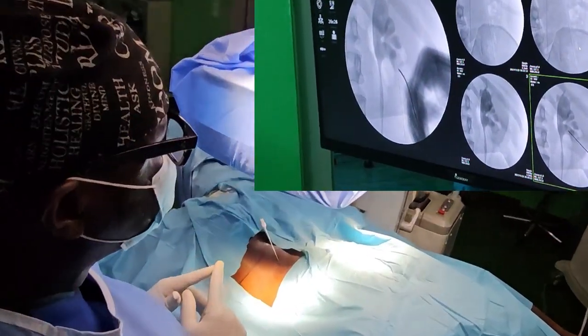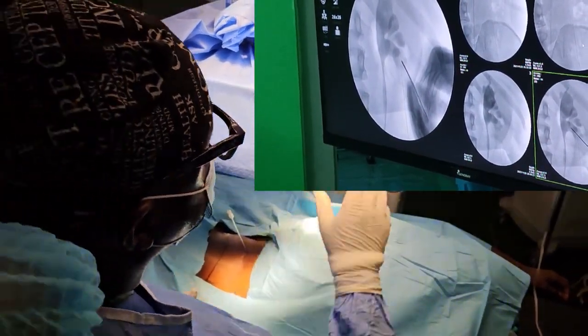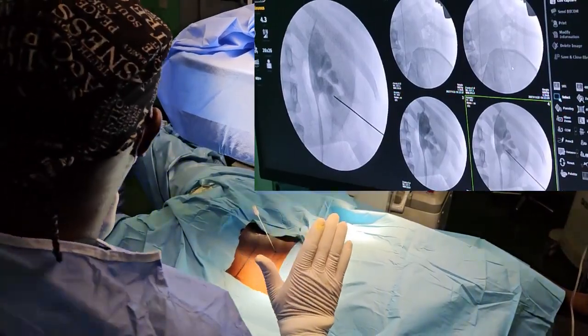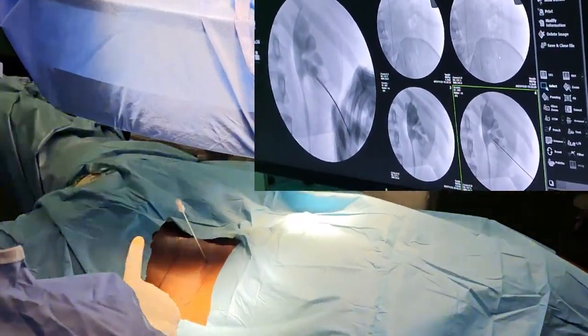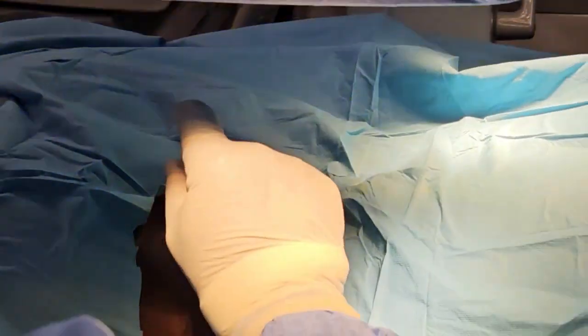So what you can see where my... no, give me a shot. Give me a shot. How do you compare your depth? Give me a shot. You see, look at the orientation of my needle. See the movement of the kidney. I should be within the system. I don't know. We'll see. I may try removing my stylet to see. So you give me, I may try.